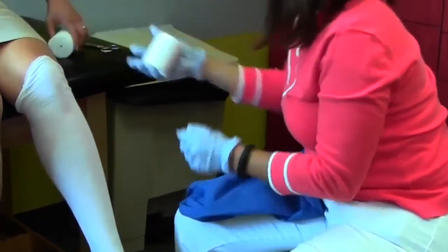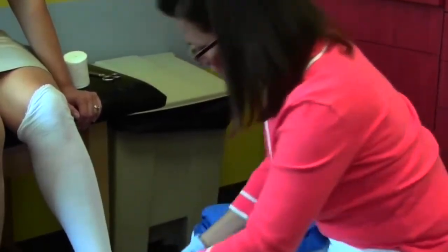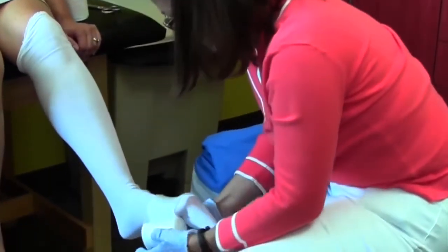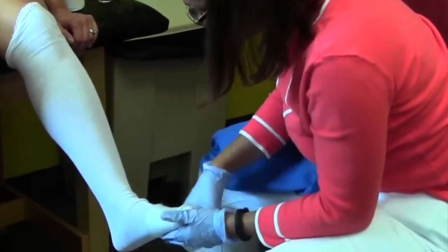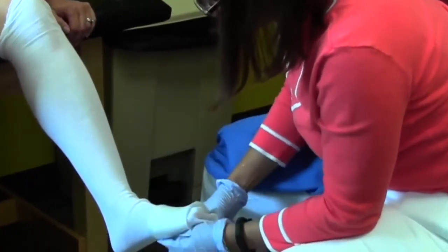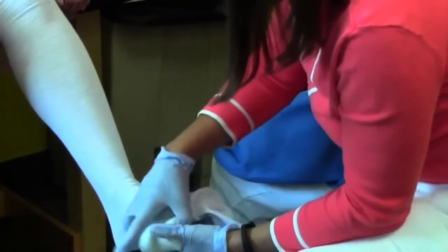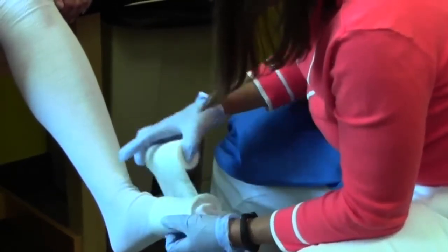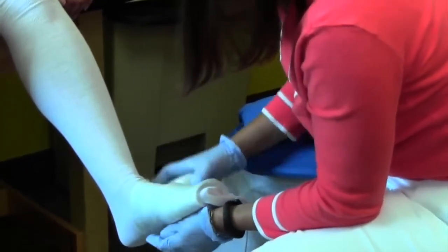Our second layer is padding. So we'll go next with a layer of soft padding. At each end of the cast, you want to be sure that you have plenty of extra layers of padding. You should plan to leave the very tips of the toes uncovered. I think if you plan to leave the entire toe uncovered, you're probably leaving too much of the foot uncovered and not getting enough stability.